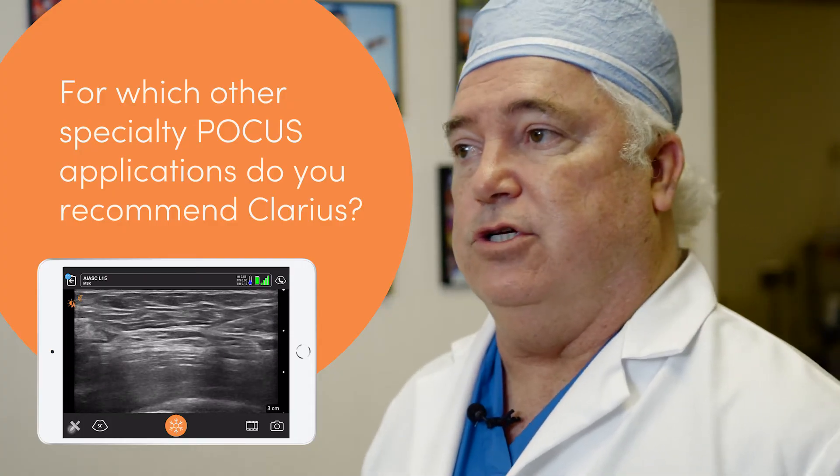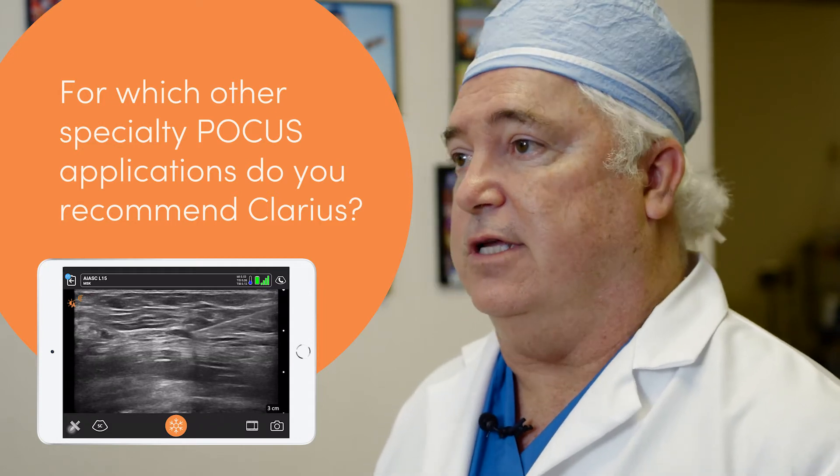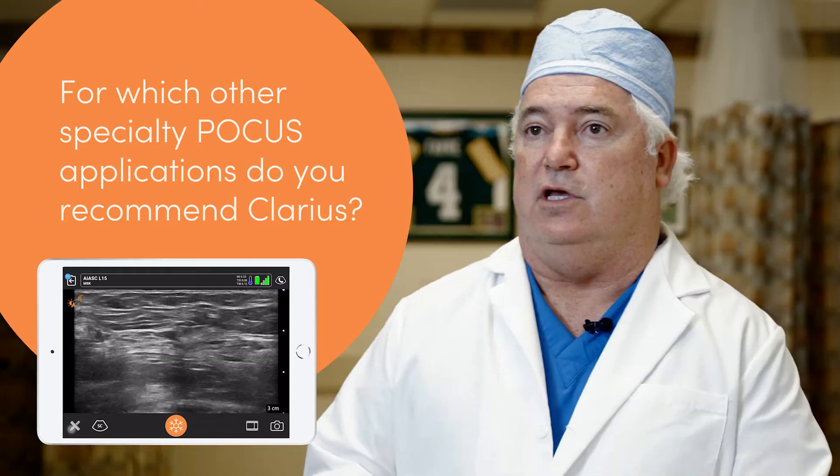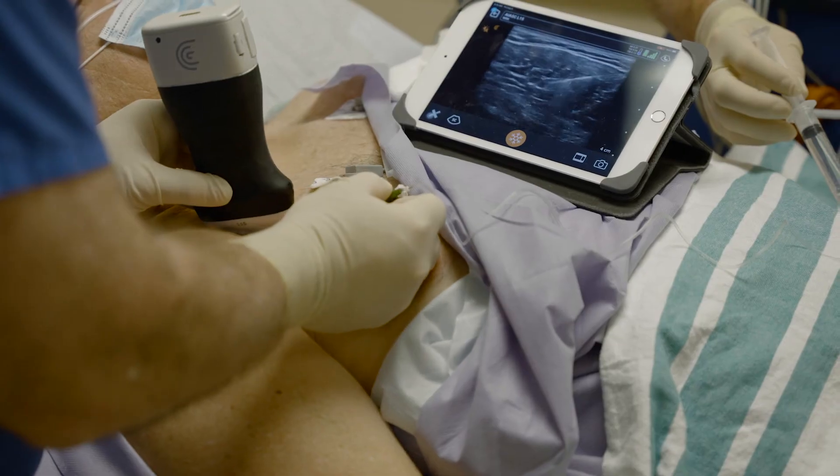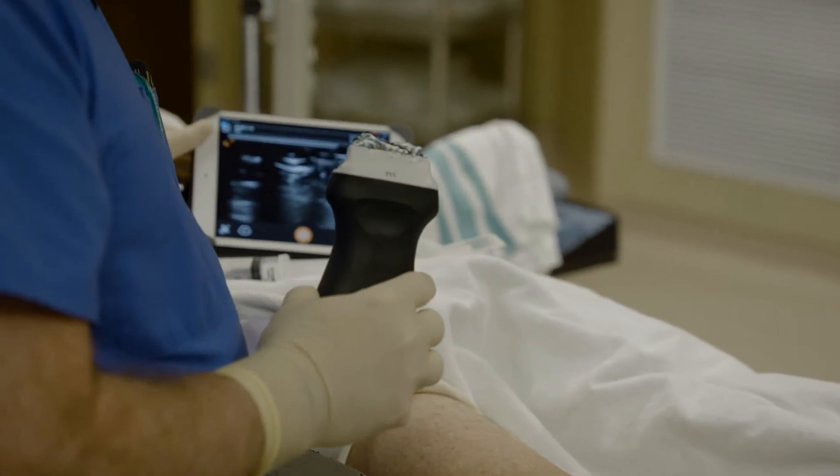The Clarius is used by a lot of different subspecialties — ER physicians, urologists, orthopedic surgeons, and many others. But in anesthesia, we're moving from spot to spot. I'm doing blocks in the pre-op area, in the operating room, and in the PACU. The ease, comfort, and mobility of the Clarius to move between these places and get the job done is really helpful — that's a real benefit in the anesthesia world.